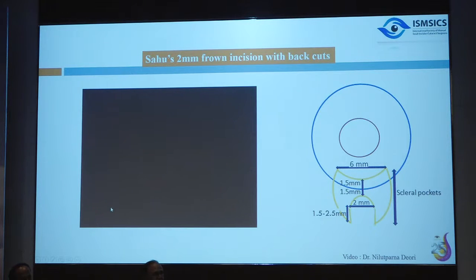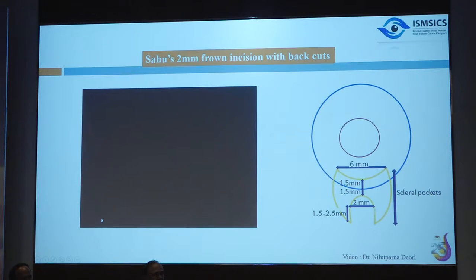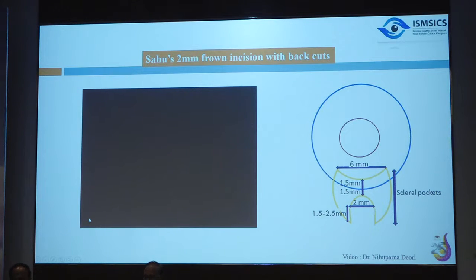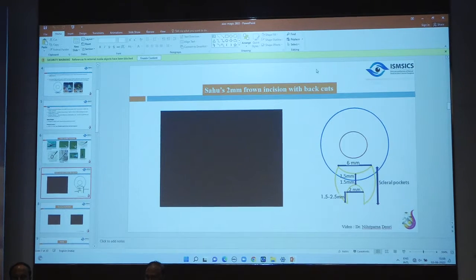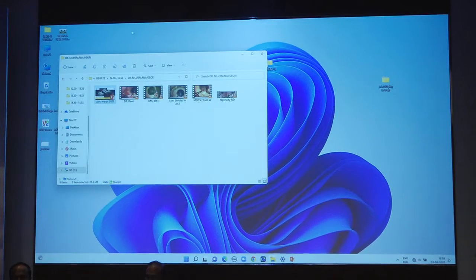A 2mm frown incision is taken 1.5–2mm behind the limbus, and back cuts are initiated from either side of the frown. During scleral dissection and pocket creation on either side, care must be taken to stay on the same plane. The corneal wound entry is 6mm to accommodate foldable or PMMA IOL.